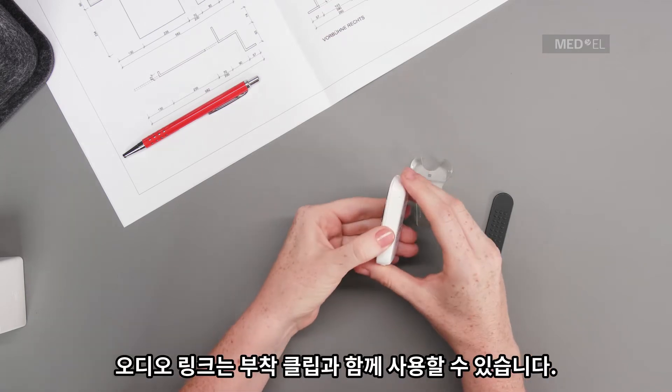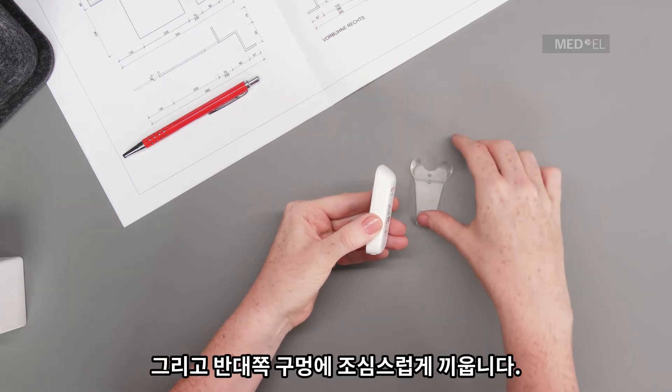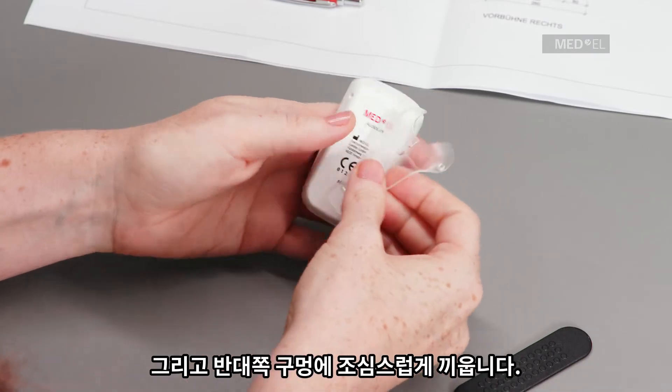AudioLink can be used with the attachment clip. Align the clip to the hole on one side and carefully snap it into the hole on the opposite side.